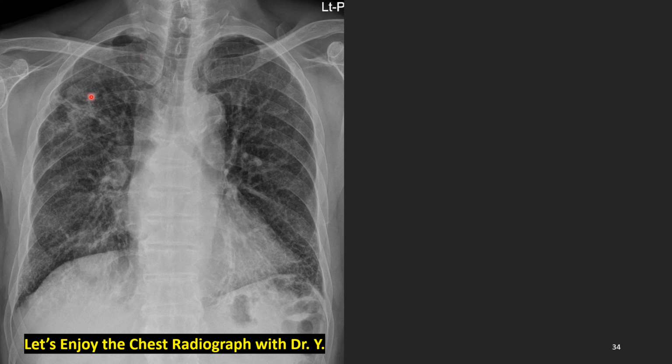The background lung is not clear, and basal lung shows honeycomb lung, okay? Heavy smoker, yes? What do we see here? Yes, 4 centimeter mass, overlapped with the diaphragm. Yes, mass. Large increased density compressing the left major bronchus, right major bronchus, and right infrahilar structures is not normal. So these are all mass.